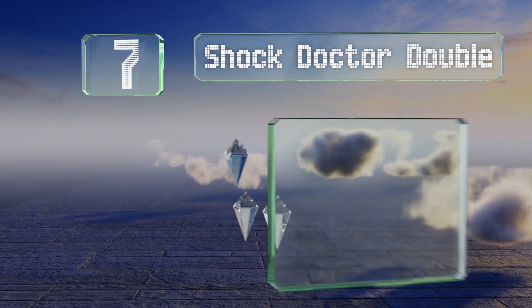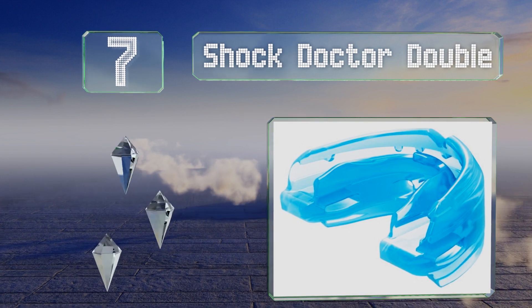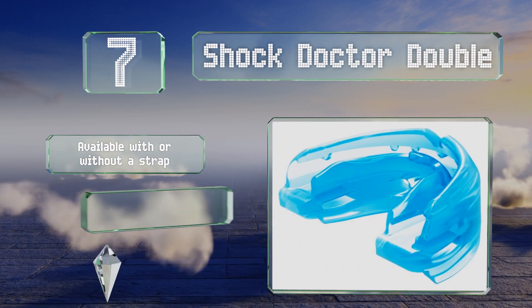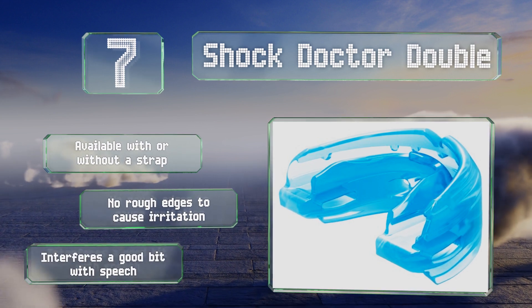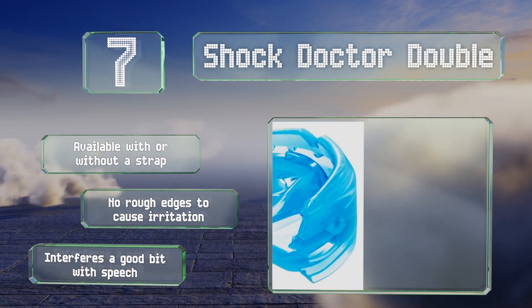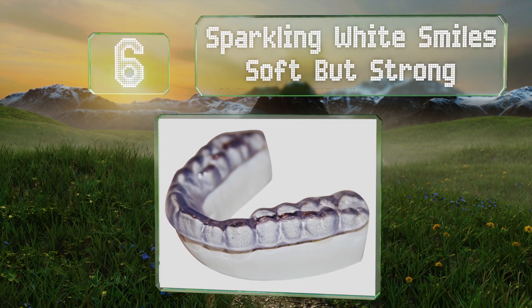At number seven, if you're trying to protect expensive orthodontia when participating in sports, the Shock Doctor Double can help. It's designed to fit over braces, palate expanders, and other maxillofacial devices, and it shields both the upper and lower teeth. This one's available with or without a strap and there are no rough edges to cause irritation, but it does interfere a good bit with speech.